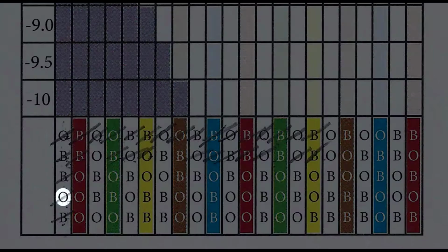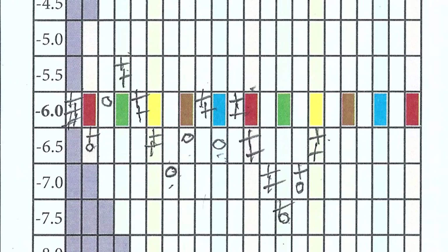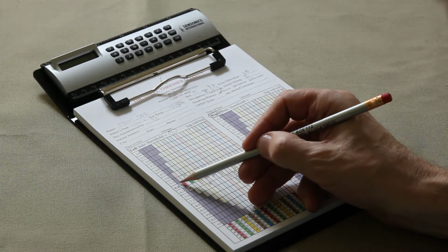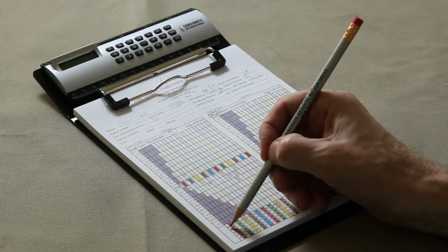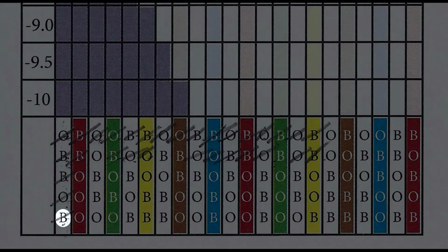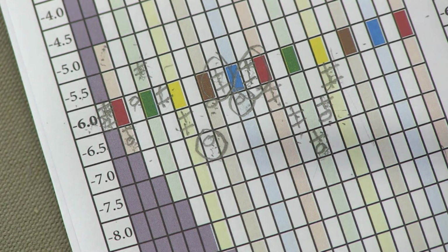Fourth trial, we presented an odor and a blank. He indicated that the first of the two was the stronger, and he was correct, so we put another plus in here. Then finally, so he's gotten 4 correct here. We're moving down to 5. The fifth trial, we gave a blank and the odor. He said the second one was strongest. He was correct. So we get all 5 correct.